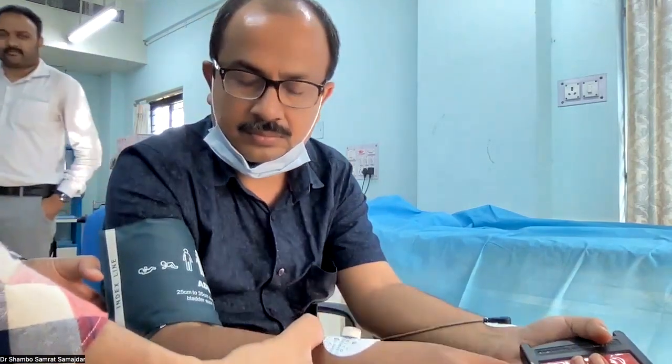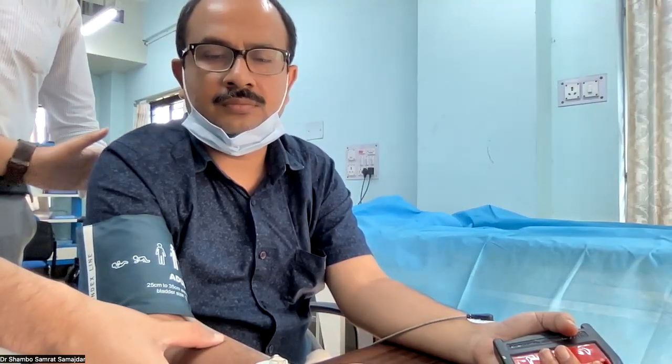Before beginning the hand grip test, we record the normal blood pressure first. So we now have the baseline value. It is also very important to have the position of the blood pressure measuring arm correct, with the elbow rested properly and the patient sitting straight. Whether the backrest has any effect on blood pressure is a little controversial, but at least the elbow should be rested properly. Now we will ask the patient to be in position and hold the bar in one hand.